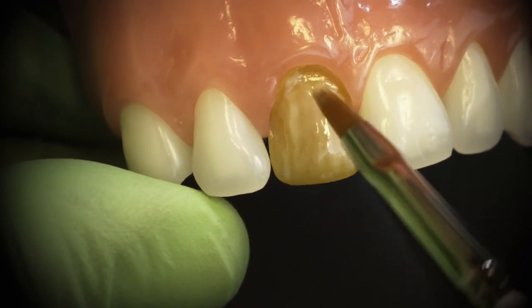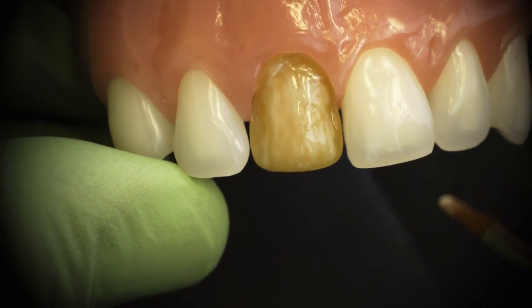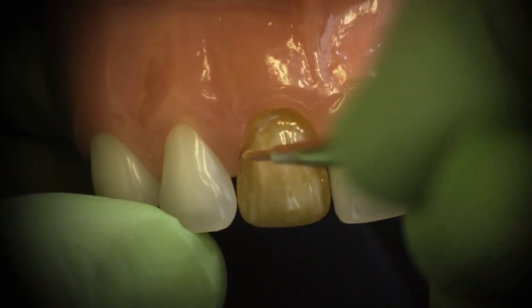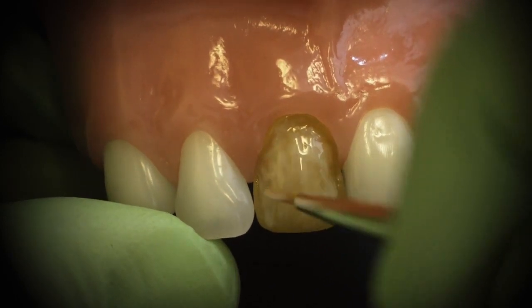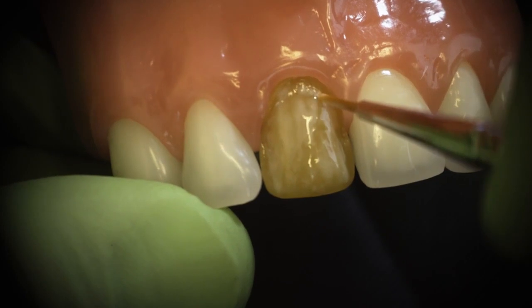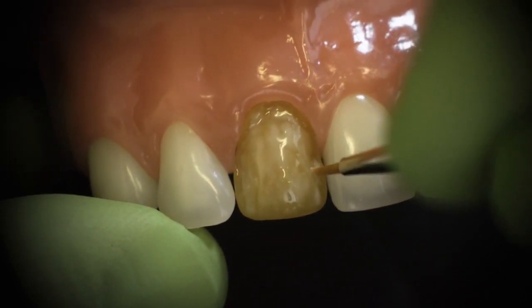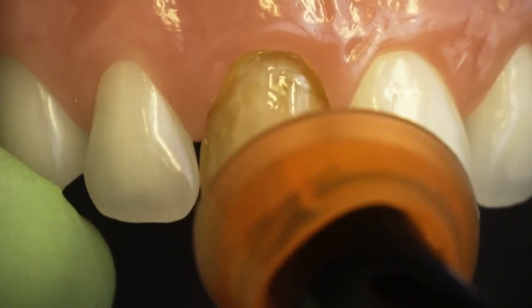Now that I've applied the pink opaker onto the tooth, I'm trying to get into the smaller areas — towards the gingival and into the interproximal. It's a good time to pull out my number one brush, my more narrow brush. I can come in with my number one brush that's been pre-wetted and add some pink opaker into the interproximals, up towards the gingival, and into the mesial proximal. Then I cure again for 10 seconds.